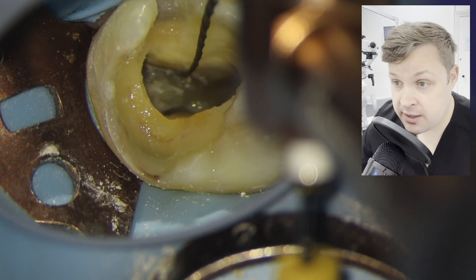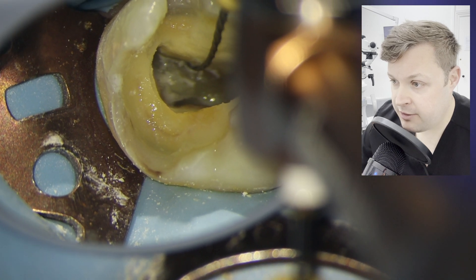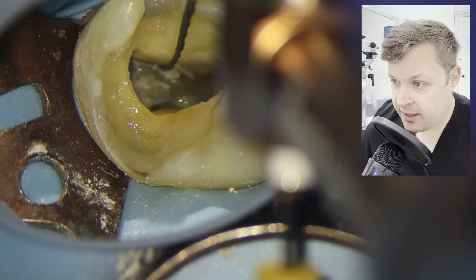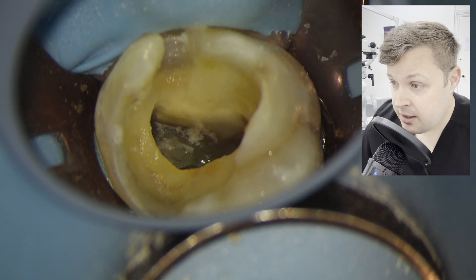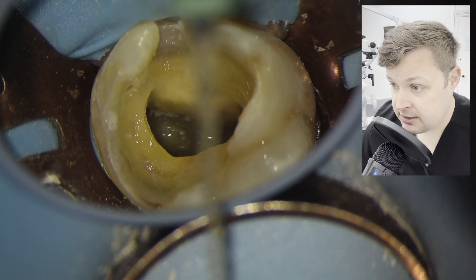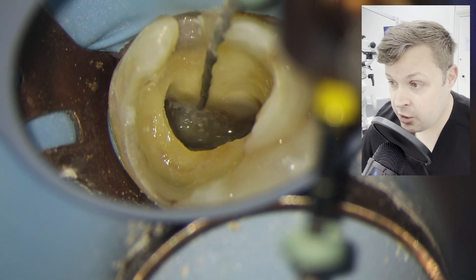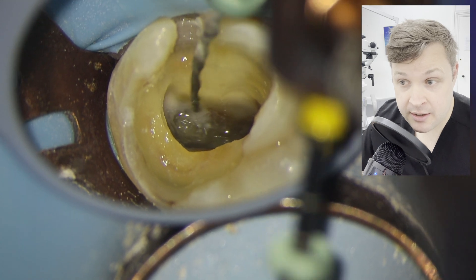I am not pushing this file in any way, shape or form. I'm just letting it go where it wants to go, very gently. I'm slowly advancing the file while also shaping the orifice. Notice there's a quite significant bend on this file and you've got to be really careful of file fracture. Using lots of irrigant is important. I'm now going to use a HyFlex 2005 file, and again I'm not trying to advance the file at all — just opening up the orifice. Advancing this file too aggressively risks ledging the MB2.